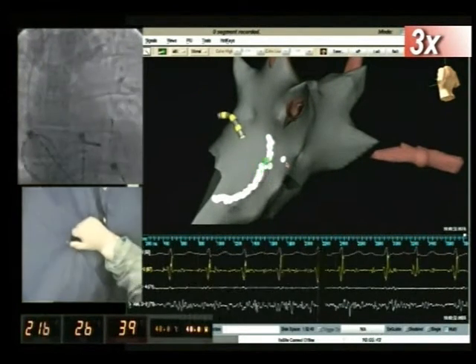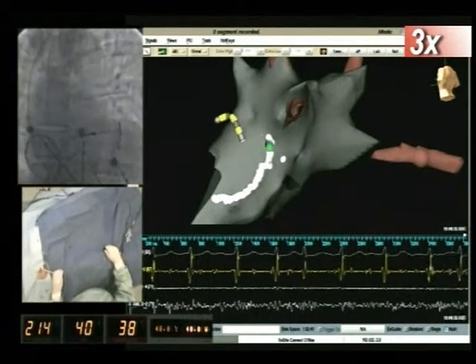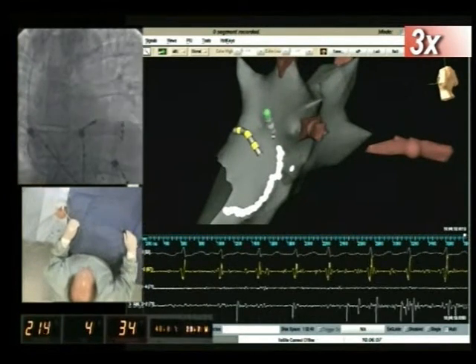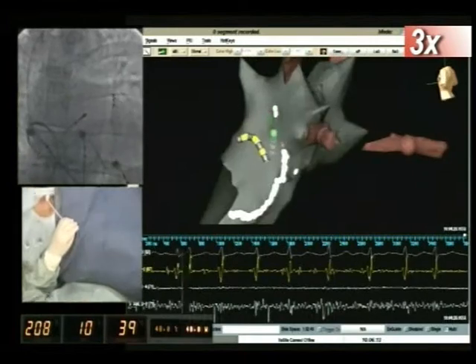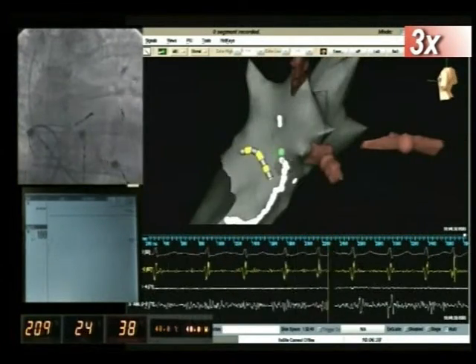of the ablation catheter. The NAVX system offers a proximity indicator that, based on the intensity of the color of the tip, allows the operator to monitor the optimal tissue contact of the ablation catheter, which when associated to potential abatement confirms the achievement of the ablation endpoint.